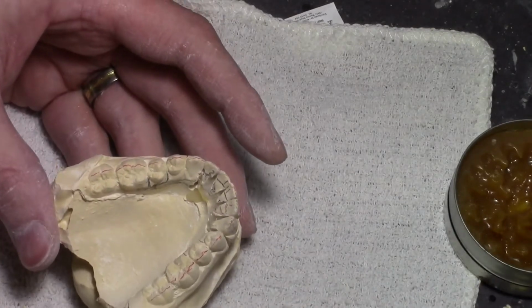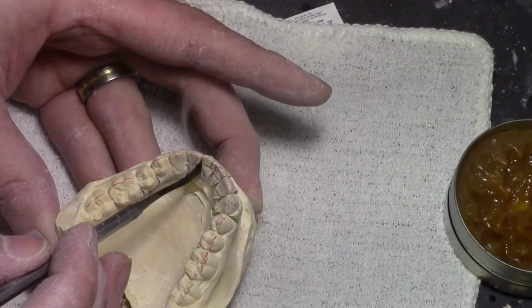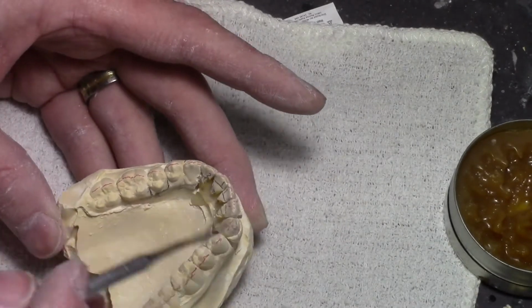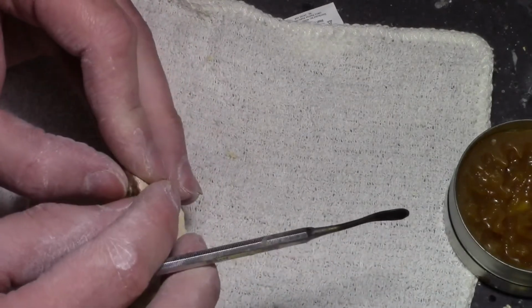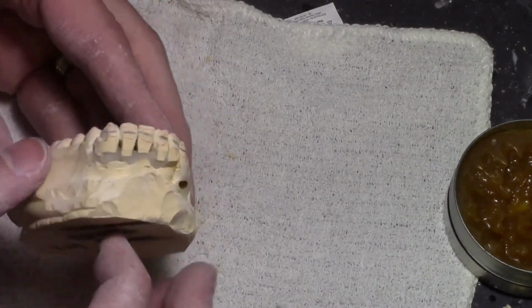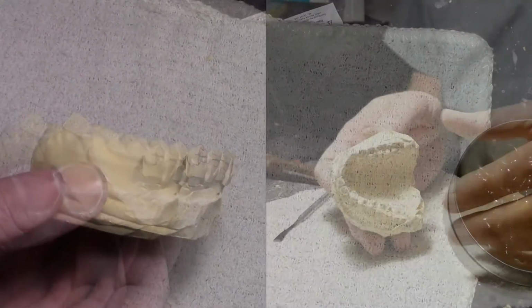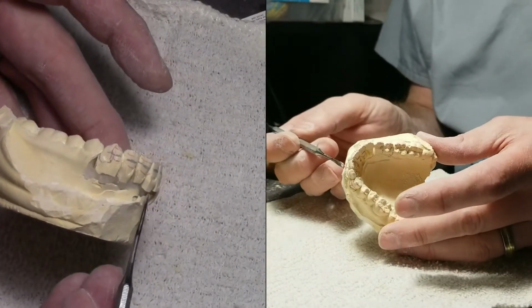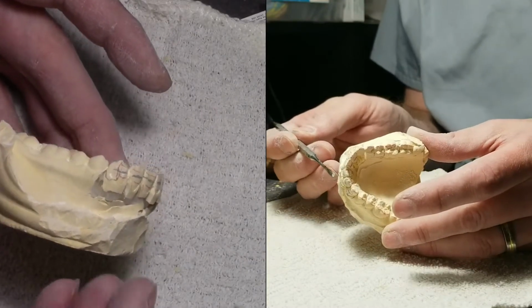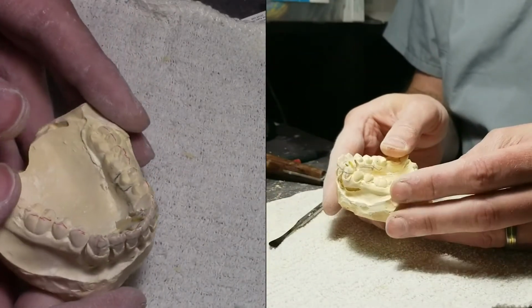So to set them, my initial set, I'm just going to heat up my little instrument here and go in between. Getting close. You can kind of see, if I can get that angle just right, how much I'm flaring out. See that? You've got to make sure you have enough bone down here so that when you flare out, you're not going to push these teeth out, which the doctor probably would have warned me if that was going to be an issue.